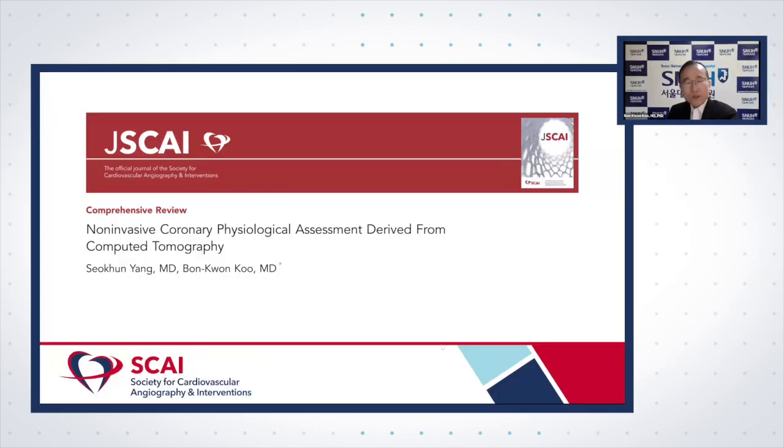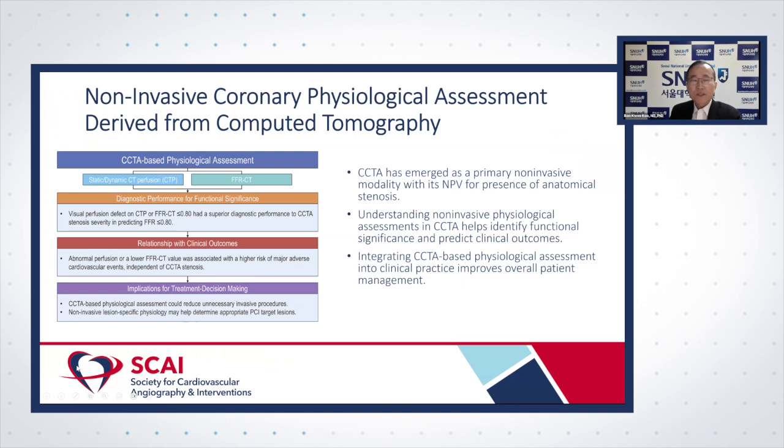Please tell us a little bit about your paper, Dr. Koo. So thank you, Jonathon, and thanks for the invitation. This paper is a review paper, and we'd like to focus on the CT-derived physiological assessment. And you know very well that it's become quite popular to do a functional assessment with the CT scan, because the beauty of CT's performance lies mainly in its excellent negative predictability. And to improve its performance, we need a functional test while doing the CT scan or the ad hoc analysis.